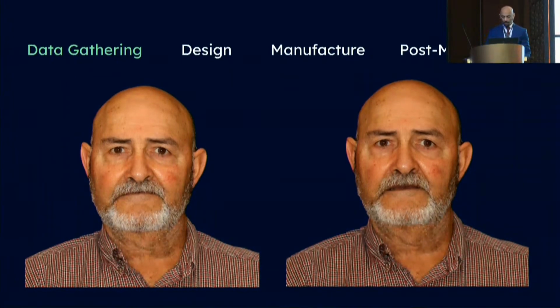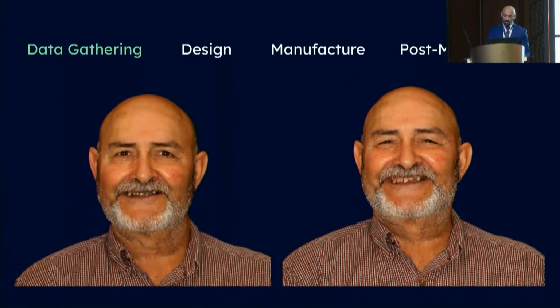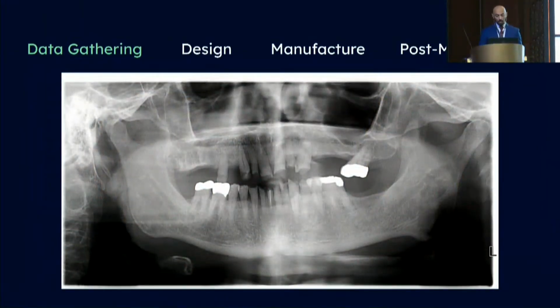On the right side, the patient at repose had an incisal show of negative 2 to 3 millimeters. Here we see the patient smiling on the left with high animation on the right. These photos start to shed light on the status of the patient's dentition, with significant tooth substance loss coupled with a corrupted occlusal plane. A look at his panoramic X-ray image reveals no pathology, with symmetrical condylar heads and normal sinus anatomy. For his age, I think he has a relatively low restorative index, which may be a good sign for his maintenance practices at home.